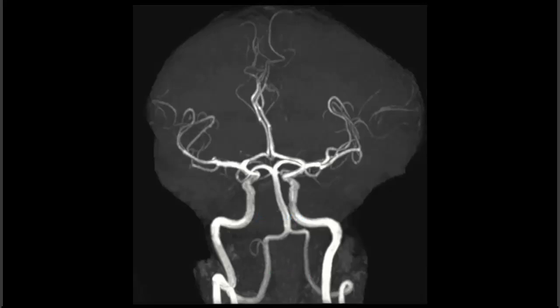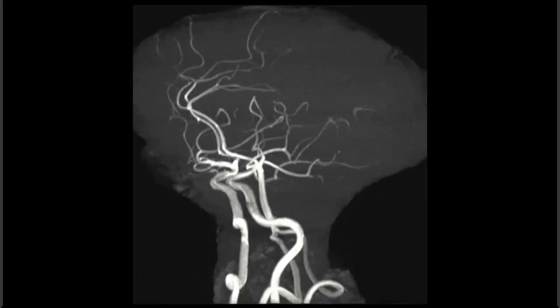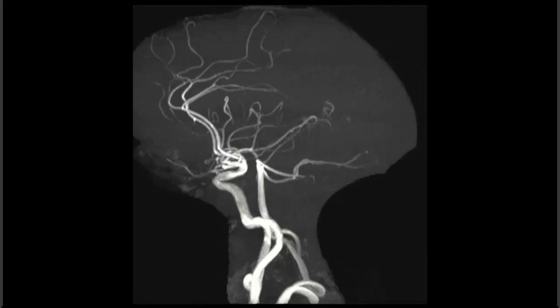Now we'll go through a series while this person is turning their head to the right. And now they are exactly to the side. We are seeing vertebral arteries back here, the internal carotids up here. This is the basilar that will serve the posterior aspect of the brain, and the internal carotids are serving the anterior and more middle regions of the brain.